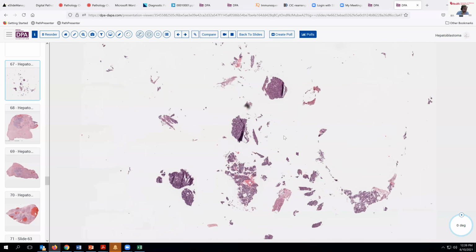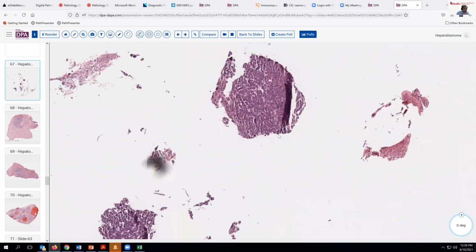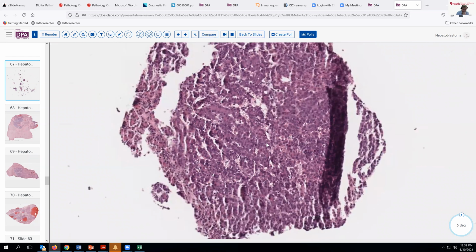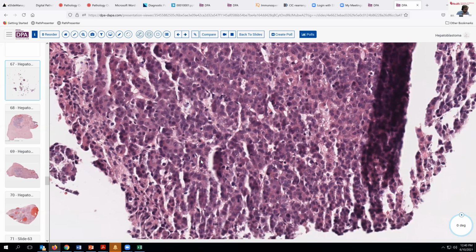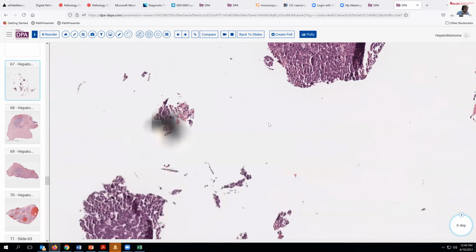This is obviously, if you were thinking adults, you were probably confused, but if you were thinking a child, well, you'd see here that you've got pretty much an immature epithelial predominant neoplasm, very solid trabecular type of growth, a few nucleoli, a little bit of maybe sinusoidal type of pattern, no stromal element identified in this.